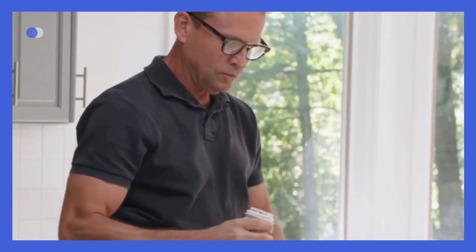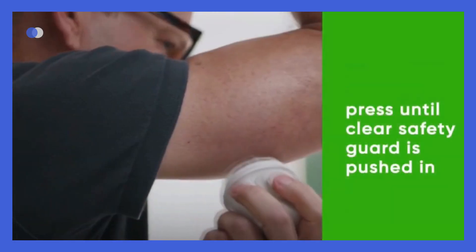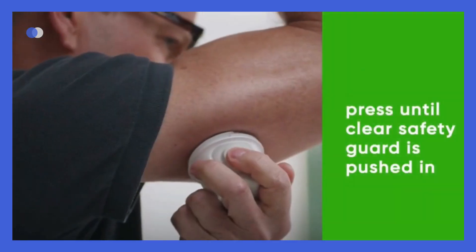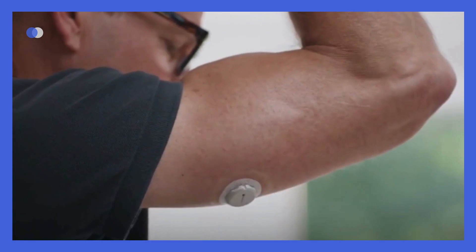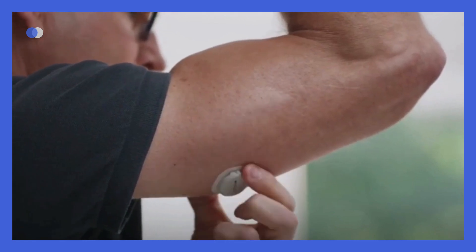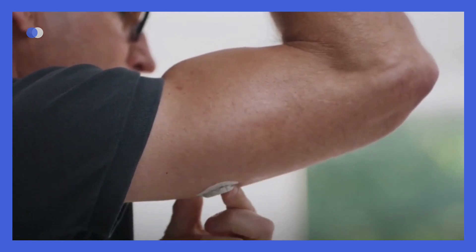Don't touch inside the applicator. Press and hold the applicator firmly against your skin until the clear safety guard is pushed in. Now push the button and remove the applicator. To help keep the patch on your skin, rub firmly around the patch 3 times, then press gently on the sensor for 10 seconds.